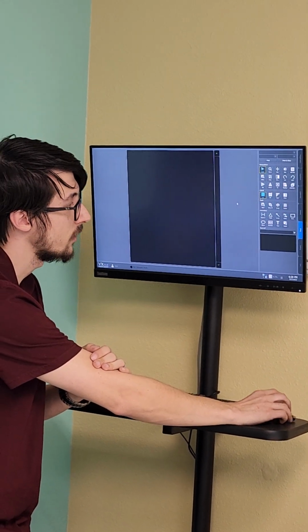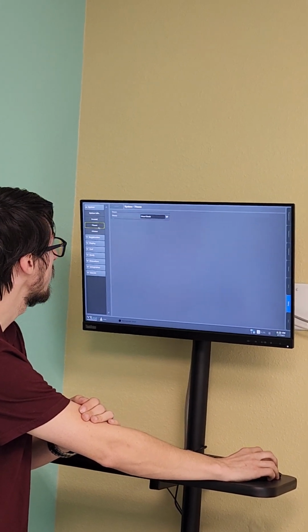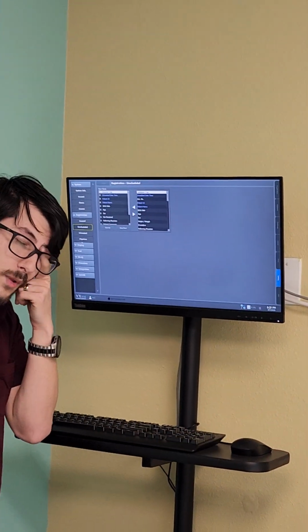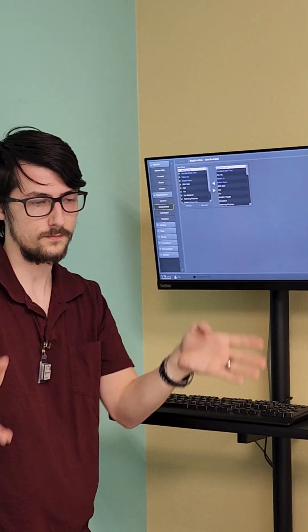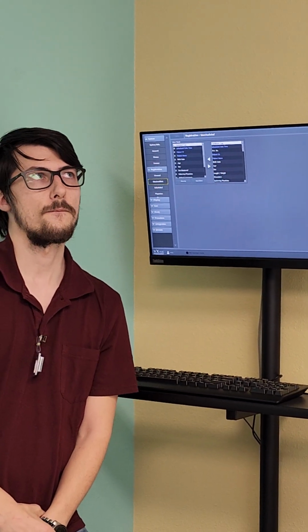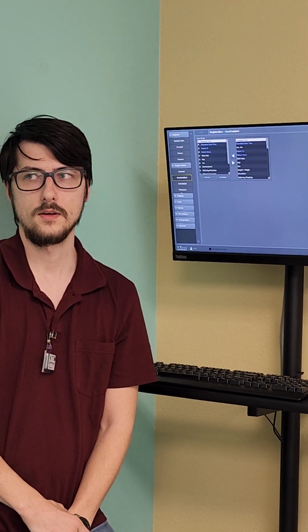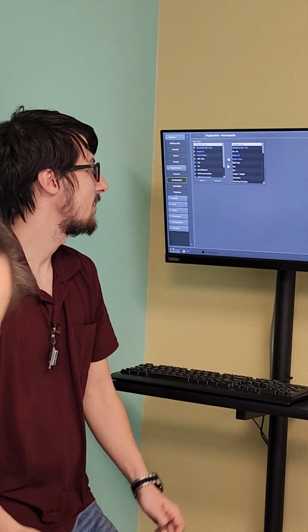Print is what that print thing did. Settings, y'all shouldn't have to mess with this too much. It just has basic settings in here. Let's say you wanted to add different information for your DICOM information and your patient setup stuff. You can change that to show if you wanted to view it or not. Does it make sense? No. Okay, that's okay. We're just not going to touch that tab.